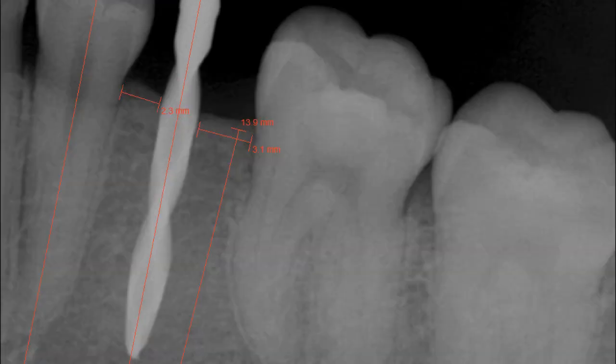This is one of the drills that I utilized, and even though we are parallel to the premolar, as the vertical red lines indicate, I am still more towards the premolar than the molar. Coronally, I am not centralized. The space between the enamel or the contact area of the premolar and my drill is much smaller than the space between the contact area of the molar and my drill. Therefore, I want to tilt the head of my handpiece slightly distally in my future drills.